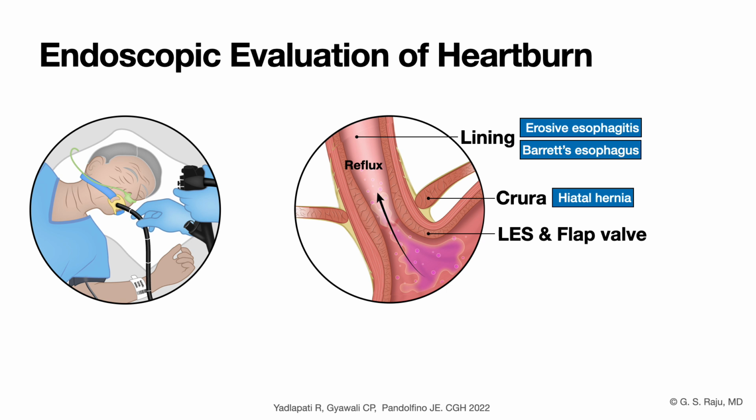And if you see no hiatal hernia, then you go down into the stomach, retroflex, look at the flap valve integrity. And this you classify based on the American Foregut Society grading. Normal flap valve is full, and in the early stages of laxness of the flap valve, you may be able to see some gap between the scope and the lesser curve, and the flap valve becomes thinner.